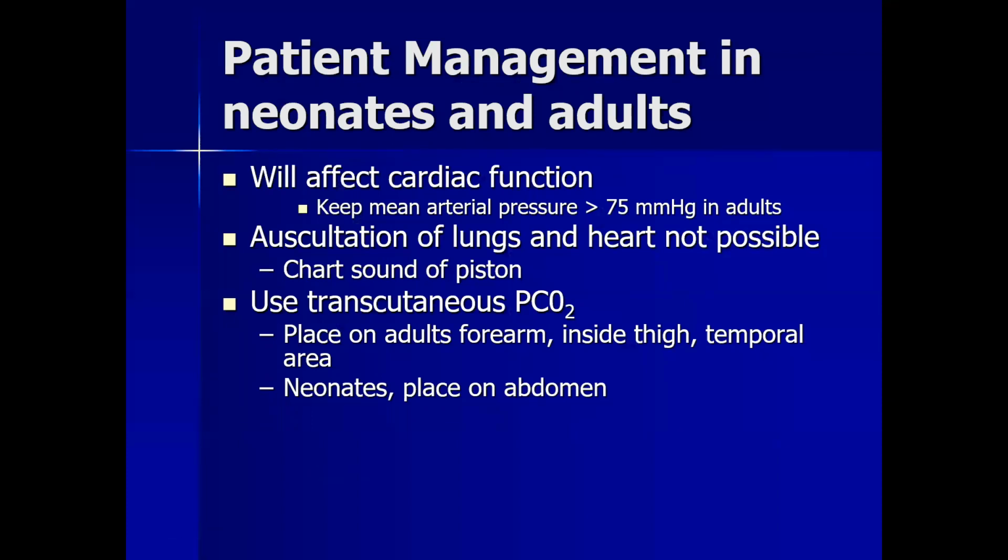Putting a patient on the oscillator and having those high mean airway pressures, it presses on the heart and drops the blood pressure. Sometimes they need to have fluids given or drugs to get their cardiac output up. It says auscultation of lungs and heart are not possible. When you listen with your stethoscope, you're hearing the sound of the piston.